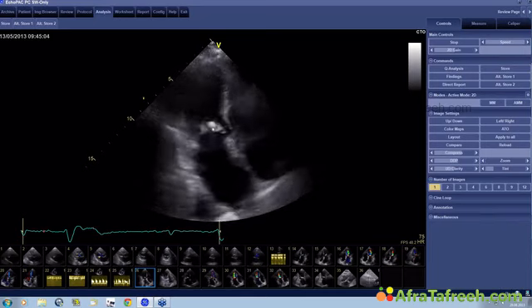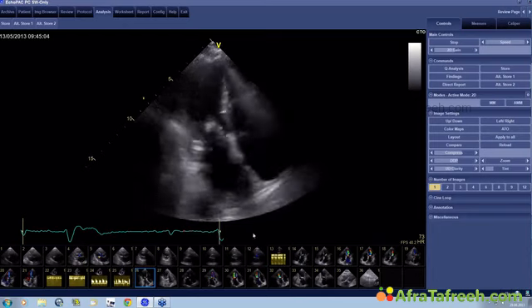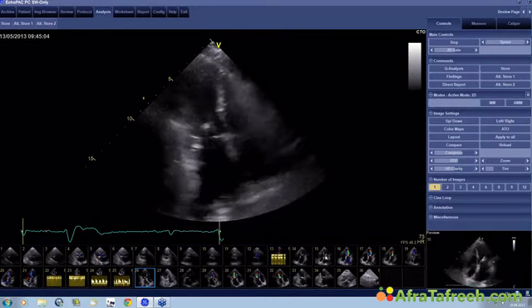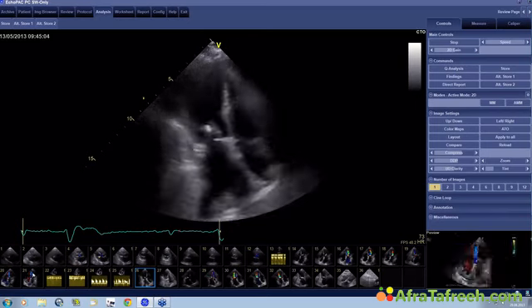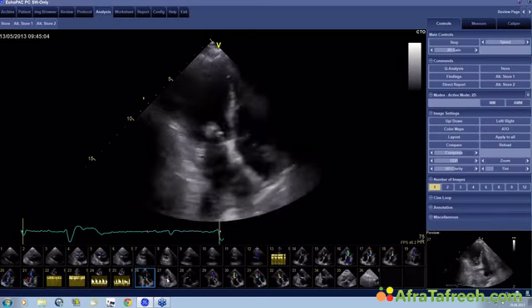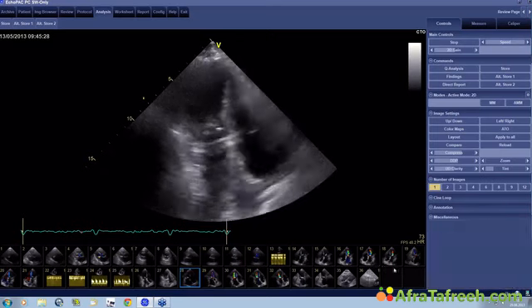And the next thing you take a look at is calcification, which is not so bad. I would say it's somewhere moderate, so maybe a 2 for this. So that would add up to 5. Then you look at the subvalvular apparatus. To look at the subvalvular apparatus, it's best to use the long axis view, apical long axis view. Let me see if I can find a good one here. This one is, I think, okay. Well, this is better. Not so good to see here.